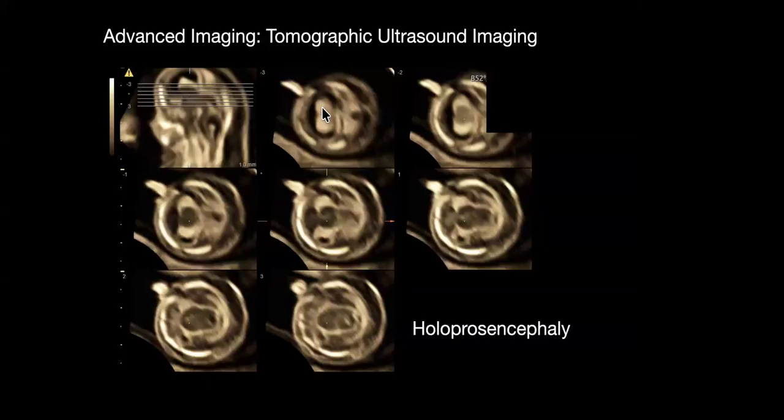And what do you guys actually see here? Notice that there is a monoventricle. You don't see the falx. So this fetus ended up being diagnosed with, or actually ultimately sonographic findings consistent with holoprosencephaly. So again, utilize the tools at your fingertips.